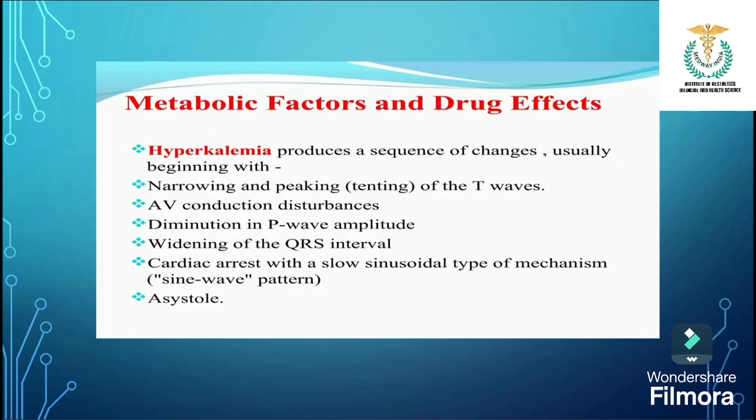Metabolic factors and drug effects are always seen on ECG. First is hyperkalemia.